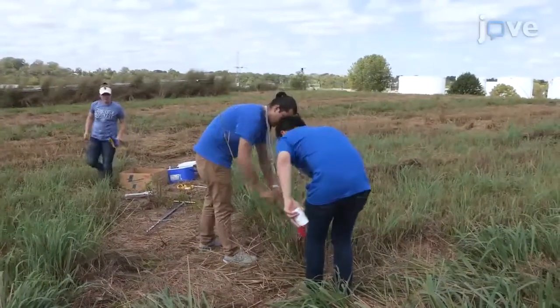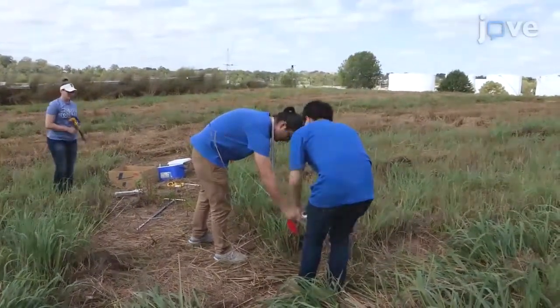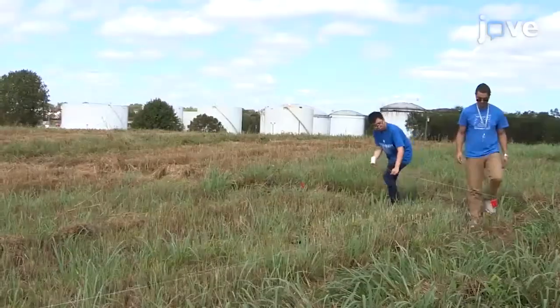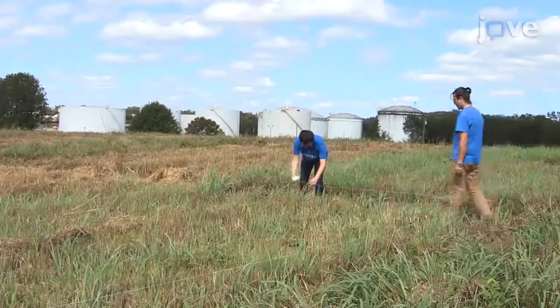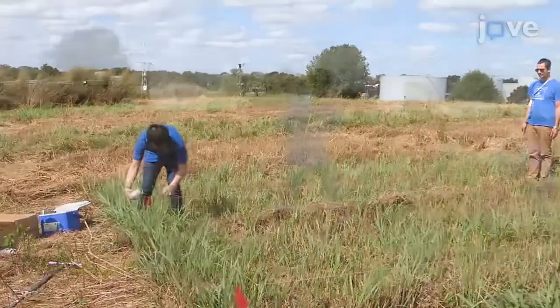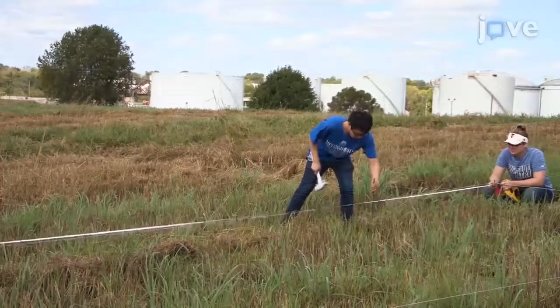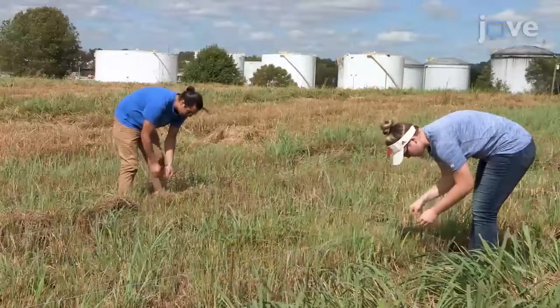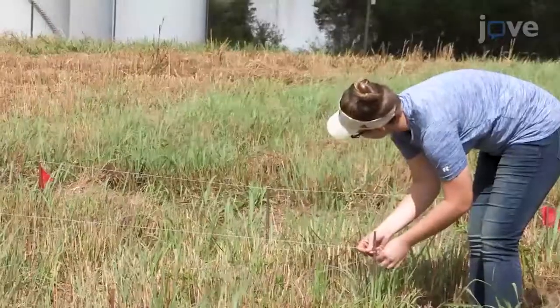Identify sampling zones within a research plot. Then, determine the number of square grids with equal length. Based on the size and shape of the research plot, the target number of square grids is expected to be between 6 and 10, so that the total number of soil samples is controlled below 30 within a plot.